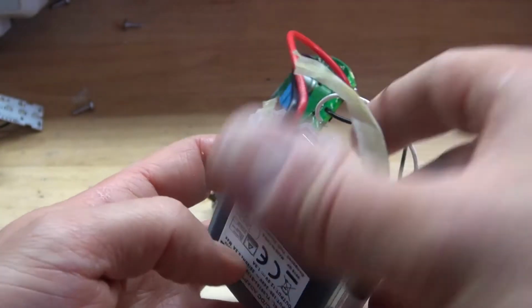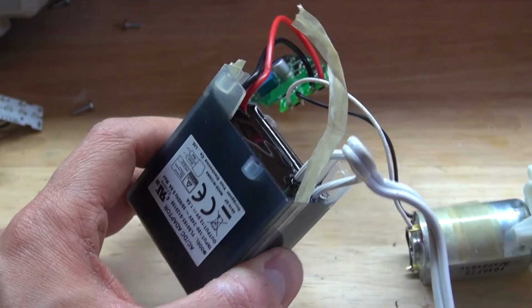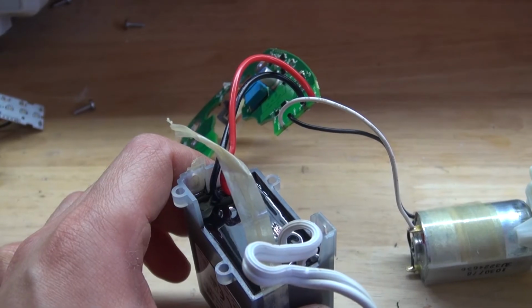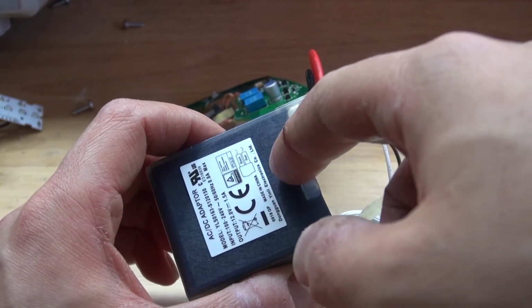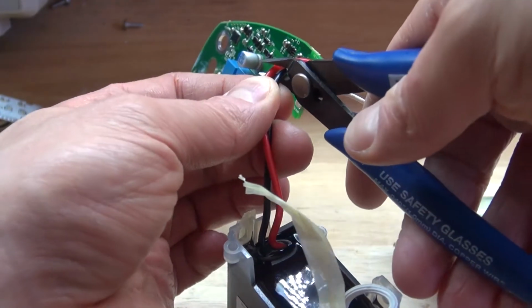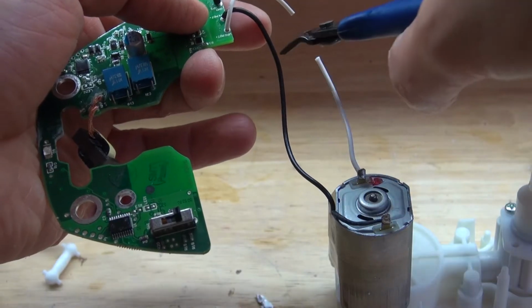And you can see that it's filled up with some kind of epoxy, which allows it to be perfectly waterproof. Very nice, and potentially very useful. Probably use this for some type of watertight projects, if I want to keep things waterproof. So now what I'm going to do is go ahead and cut these wires and remove the circuit from this power supply, because I'm going to keep this power supply for something else.